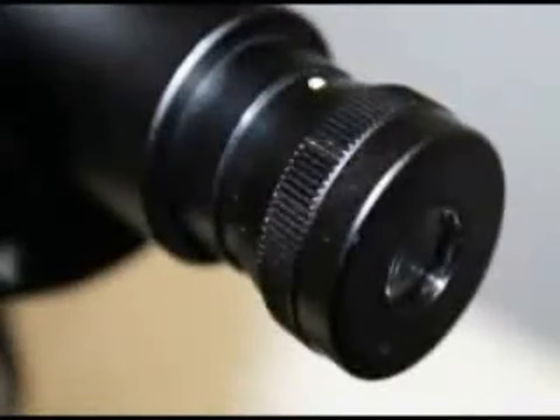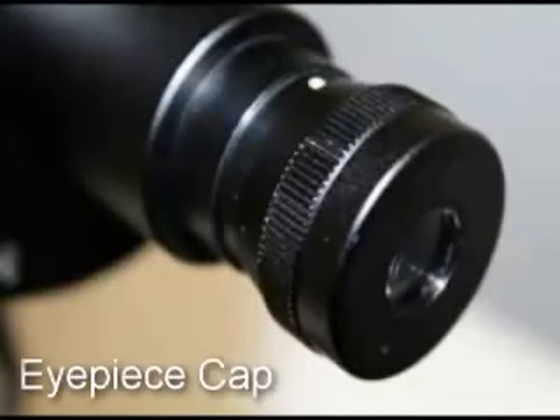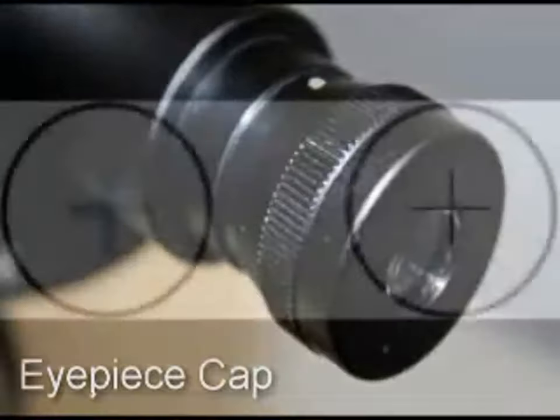Before taking a keratometry reading, the first thing that should be done is to focus the eyepiece. Position the white back occluder vertically in front of the instrument. Turn the eyepiece cap counterclockwise as far as possible. Looking into the eyepiece, turn it clockwise until the plus sign becomes sharp and in focus. After you focus the eyepiece, turn the instrument on and look through the eyepiece. You will see a plus sign. Turn the eyepiece cap clockwise until the plus sign becomes sharp and in focus. Do not turn the eyepiece cap back and forth as this will stimulate accommodation.